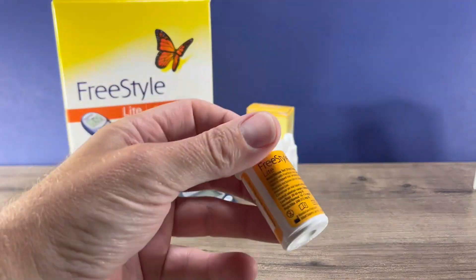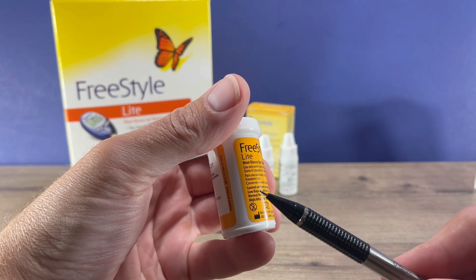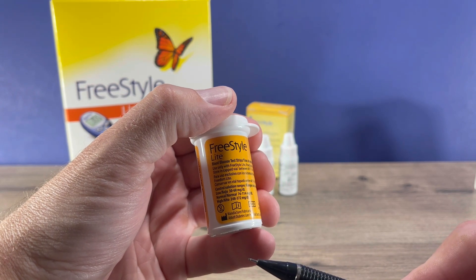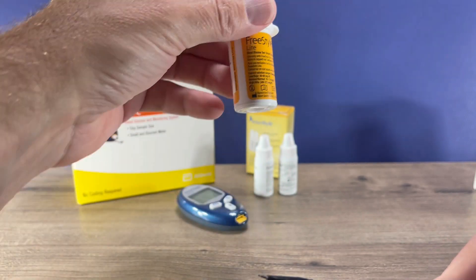Your test strips have the control ranges printed on them — it has low, normal, and high. We have normal control solution, so the range should be between 76 and 114 when we test it.